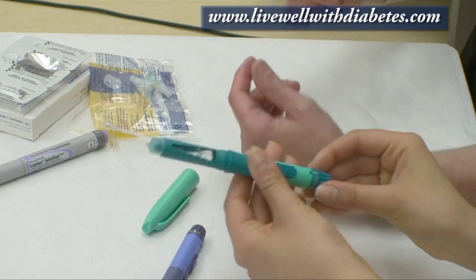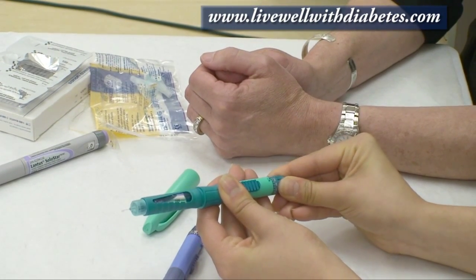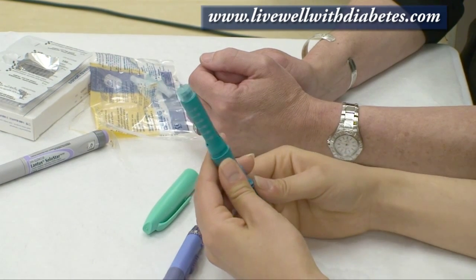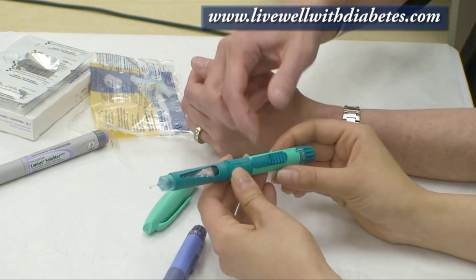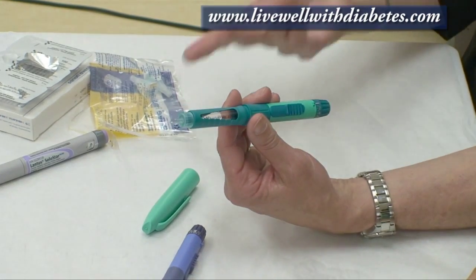Do you want to try? Sure. So dial up to four: one, two, three, four, and point it up. Perfect. Once you've done that safety check — also called priming — then you're ready to dial your dose.